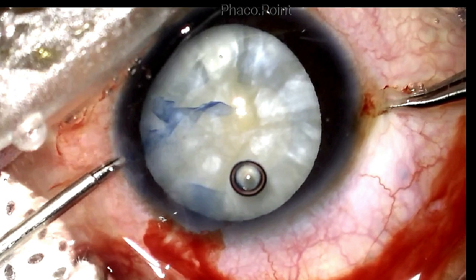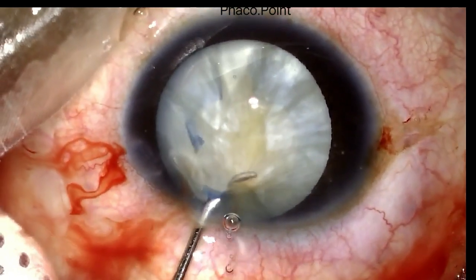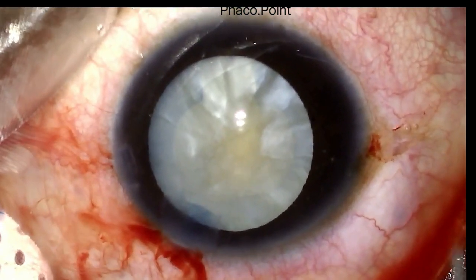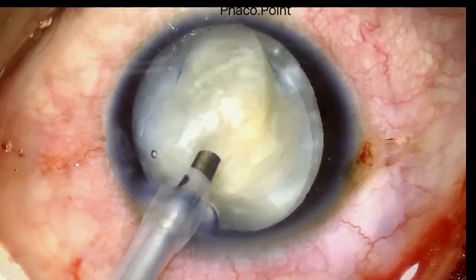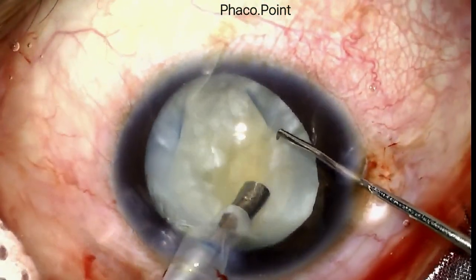As you can see, the opening in the anterior capsule is now adequately large. After releasing some of the cohesive viscoelastic used for the rhexis out of the eye, I perform a very gentle hydrodissection. Viscoelastic is then reintroduced into the eye, followed by introduction of the phaco probe and a short sharp chopper.